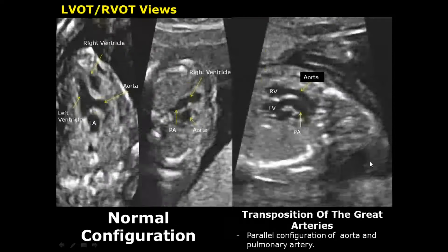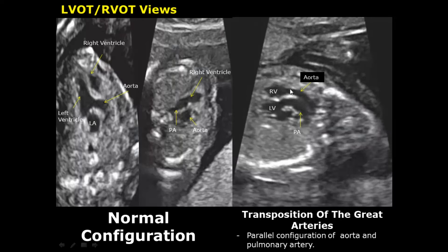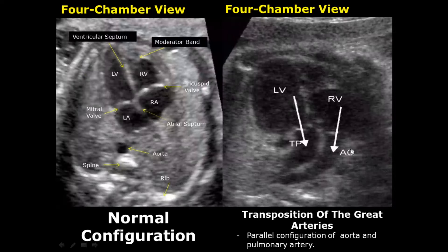In transposition of the great arteries, the aorta and pulmonary artery switch places. Normally the aorta and pulmonary artery cross each other — they are not parallel — but in transposition of the great arteries they have a parallel configuration. This parallel configuration is a key sign of transposition of the great arteries. In this four-chamber view, you can see the parallel configuration, which is not present in the normal view.